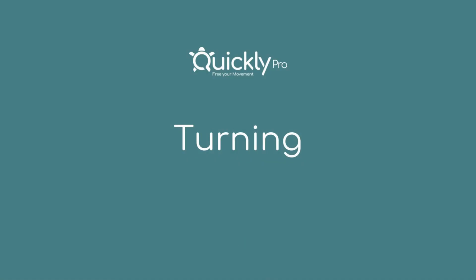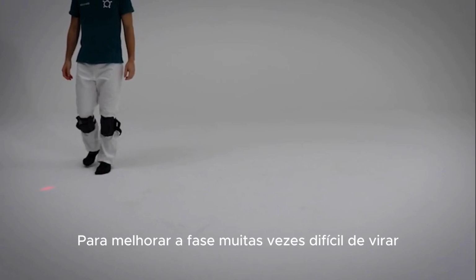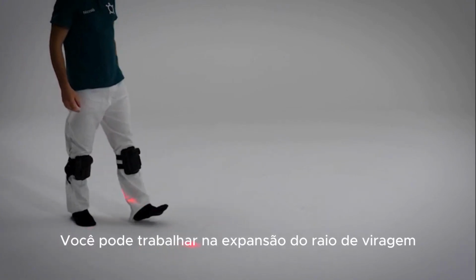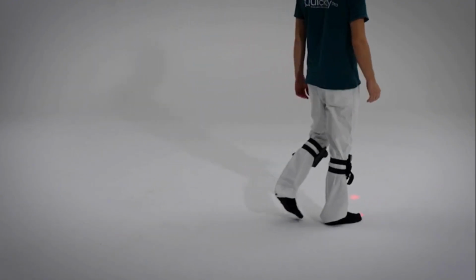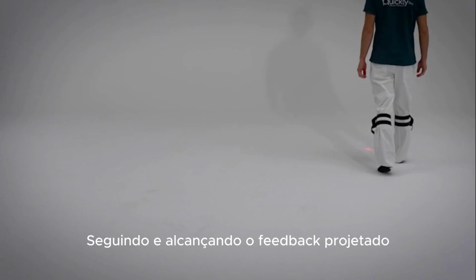Turning. Very useful training in patients with Parkinson's to improve the often difficult phase of turning. Using one or two devices, you can work on expanding the turning radius, looking for greater safety and stability. The patient is required to turn by following and achieving the projected feedback.